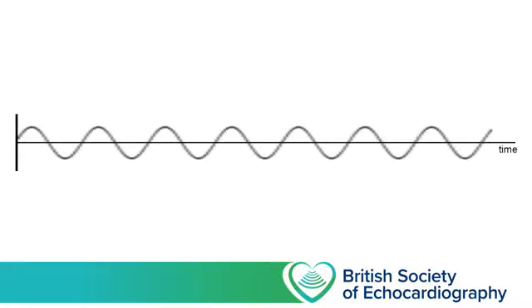Okay, so let's have a look at why this occurs. Let's imagine that there is a wave returning to our probe, and we want to work out the frequency of that wave. Well, if we can see the whole wave, then it's relatively straightforward. All we need to do is work out the duration of one period, the time between two peaks, and then our frequency will simply be the reciprocal of this.